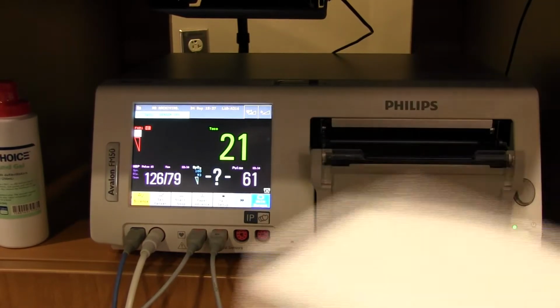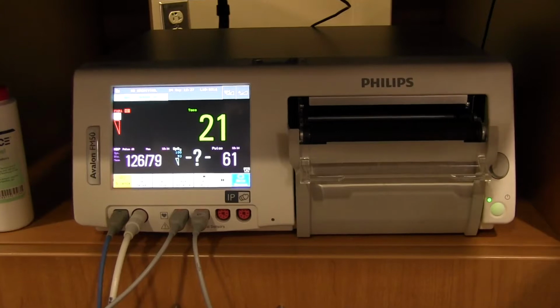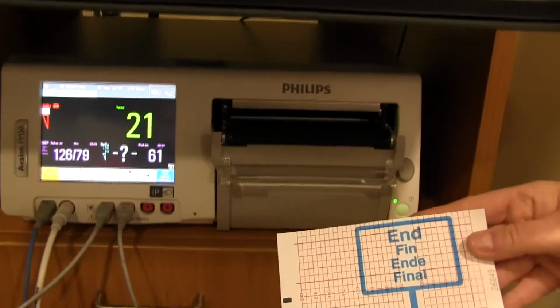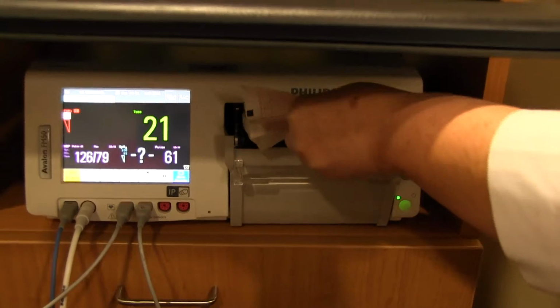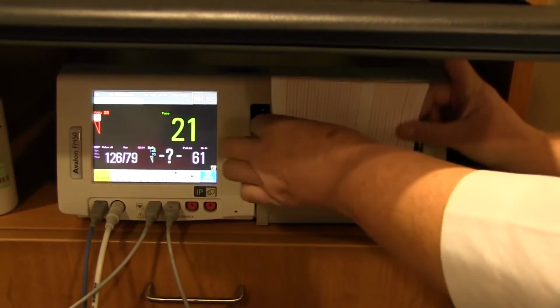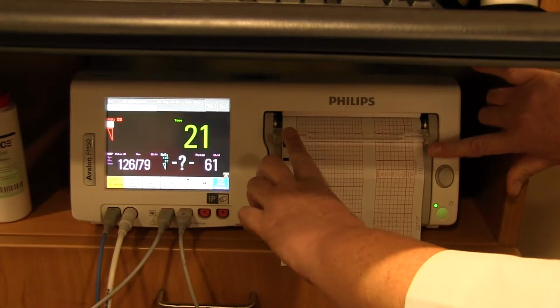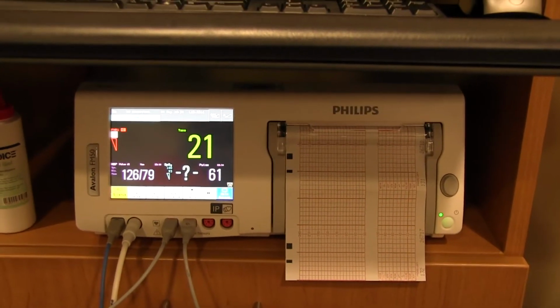Move the transparent paper guide forward. Place the paper in with the bottom side down, and then feed the paper through the paper guide. Close the paper drawer and then close the paper guide. You will hear a click when the paper guide is closed.